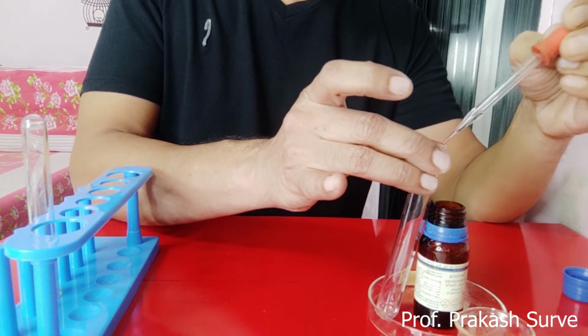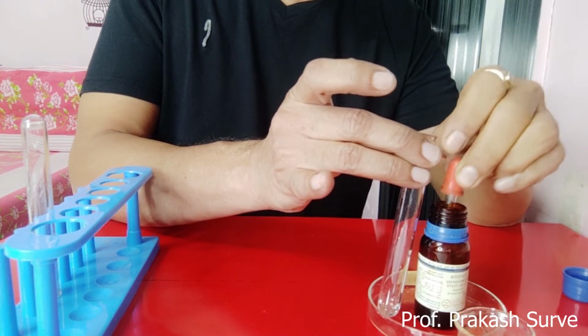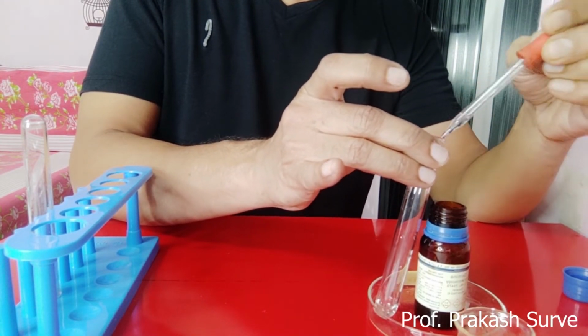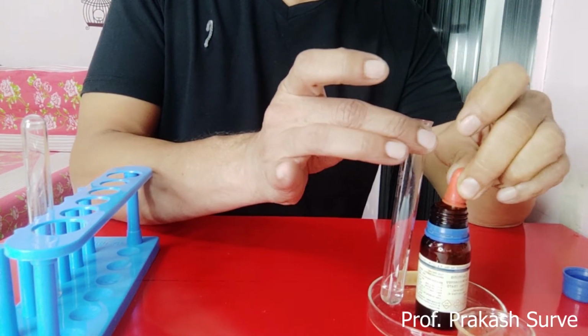I'll repeat again, this is concentrated nitric acid, so you have to hold the test tube carefully.